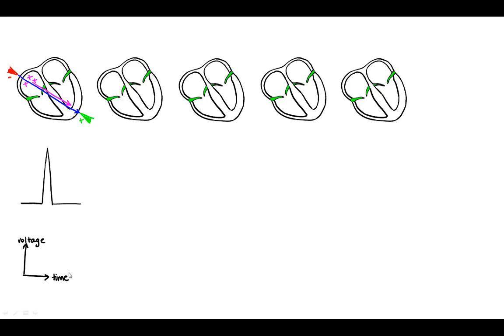So imagine that we've put our electrodes in exactly the same places. And so our blue vectors are all going to look the same again. And now our pink vector, which represents how charges are moving inside of the heart, can change. So let's draw in various directions that the charges could go. So in this case right here, we would see that the direction of charge motion has some kind of component that's parallel to the blue vector. So there's something in common with it, but it's not completely in the direction that it's supposed to be in.